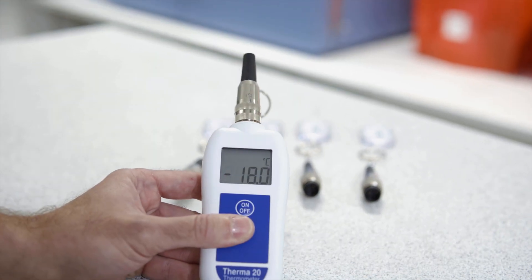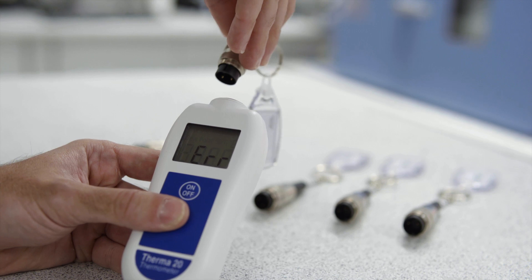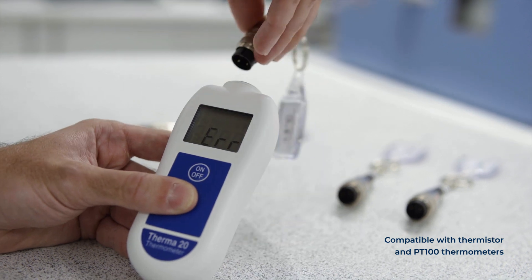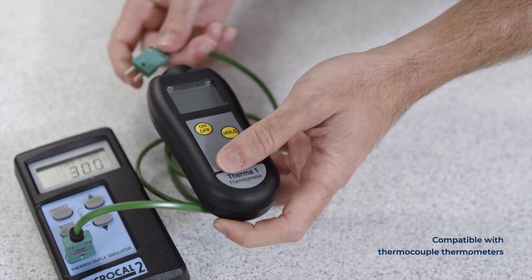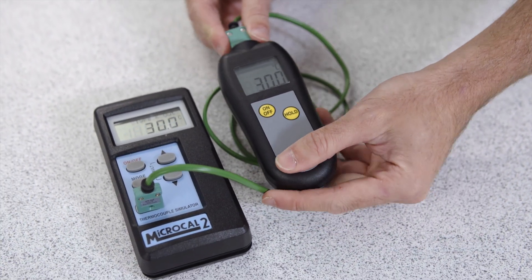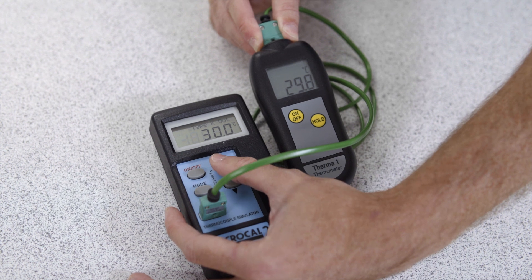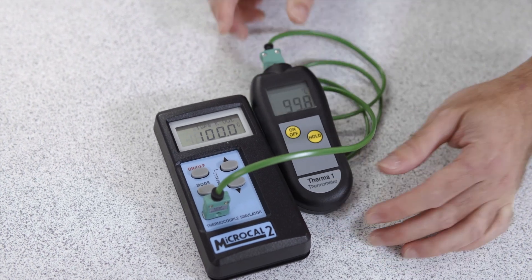Test caps and microcals are an easy way to check the accuracy of your instrument. They work by simulating a specific temperature — when connected to your thermometer, they compare your thermometer reading with their set temperature. Test caps are compatible with thermistor or PT100 thermometers and are available in a range of singular set temperatures for different requirements. Microcal calibrators are made for thermocouple thermometers and have multiple adjustable temperature points, so users can calibrate their thermometers at different temperatures very quickly. These are both quick, easy, accurate and economical choices. However, your probes also need to be calibrated, and we always recommend checking your instruments and probes as a system using one of the other methods discussed in this video, such as an ice bath or dry block calibrator.